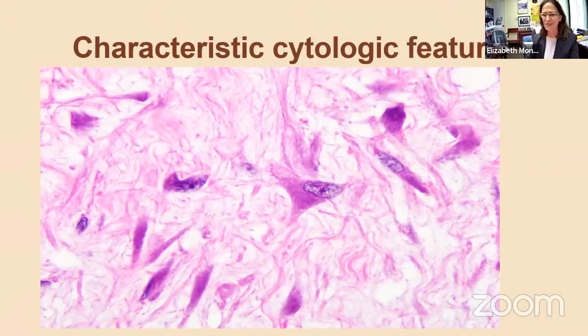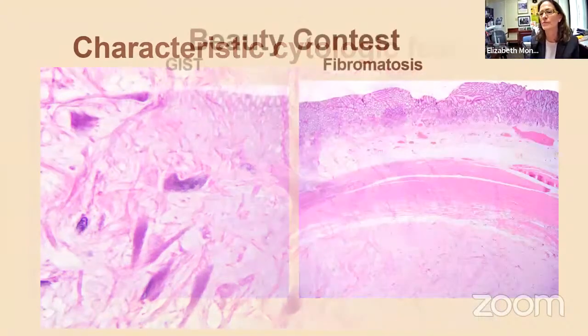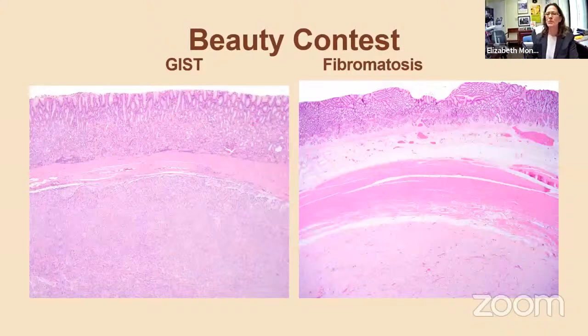And this is, of course, a very high magnification image of a fibromatosis, and they're myofibroblastic. So the cells will have amphophilic cytoplasm, and some of them have this rather stellate contour, and each cell has a delicate nucleolus that's perfectly round, and you'll see it in many of the cells, depending on the plane of section.